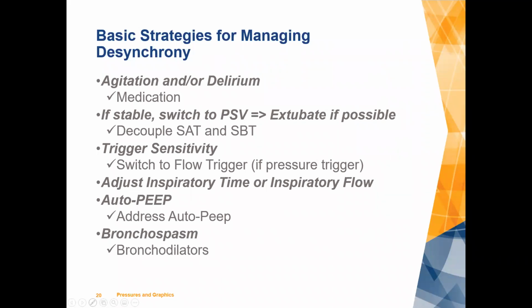Asynchrony, again, has so many different types, so it's really a divergent fix. It's not one thing that we're doing, but if the cause is agitation or delirium. Agitation is what you might get with a new patient you got from, let's say, the ED. Agitation might be what you get when you're giving a patient a sedation holiday to attempt a spontaneous breathing trial, as we should be doing with most of our mechanically ventilated patients. Liberating them early almost negates this presentation overall. Get them off safely, etc.